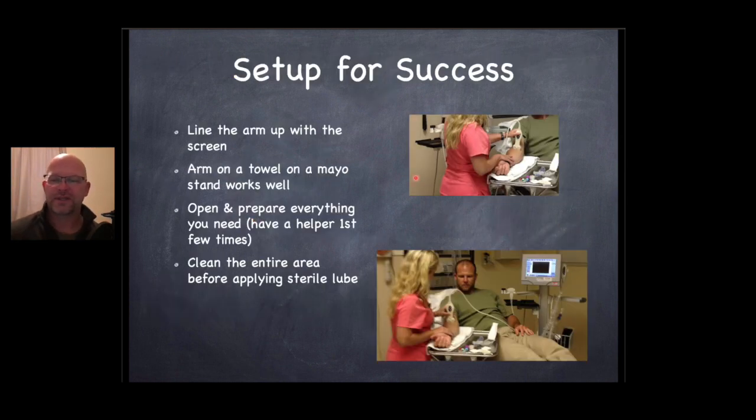Set yourself up for success. I remember when I worked in the ER, it was not uncommon to squat down and hold their arm down, and you're in these crazy positions. I worked on a helicopter, and you get a lot of crazy positions trying to get IVs in some of the smaller aircraft.